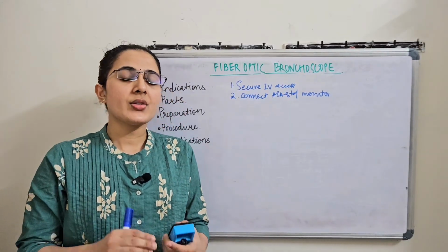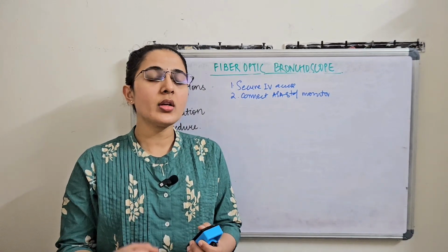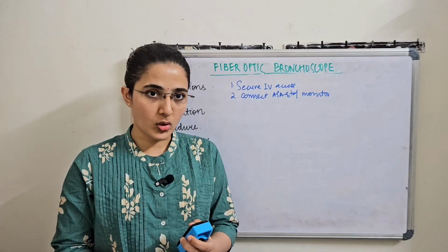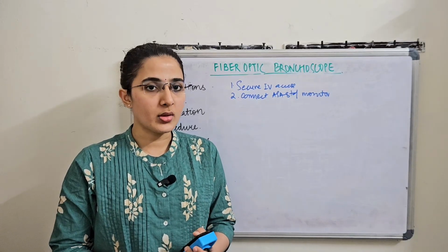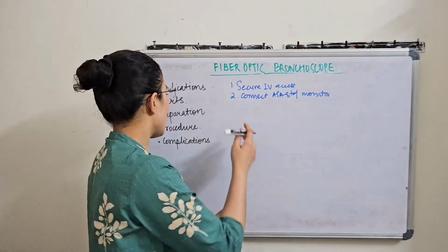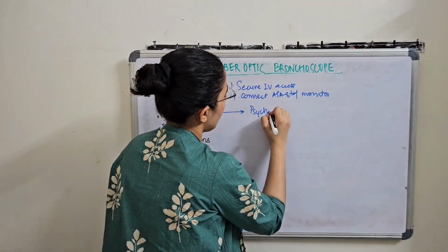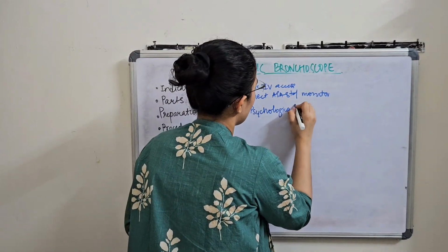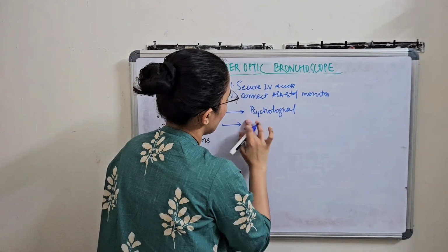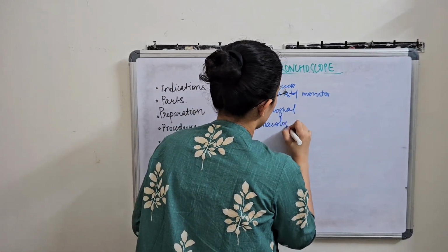Once the patient is psychologically prepared, we will see what are the various methods or measures which we can follow for a smooth fiber optic intubation. As soon as the patient arrives, when we are starting the preparation, first we saw the psychological preparation of the patient. Then we see what is the pharmacological preparation which we have to do.